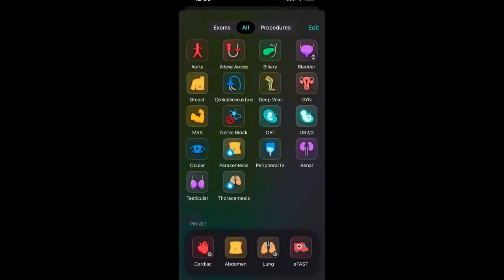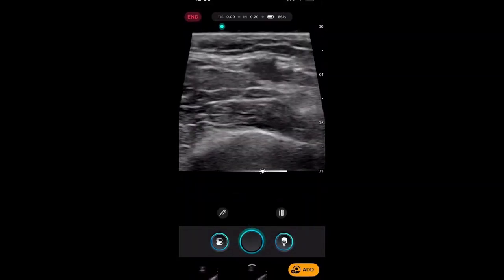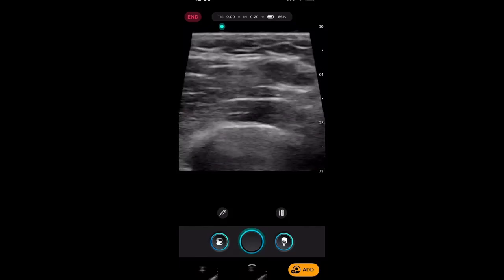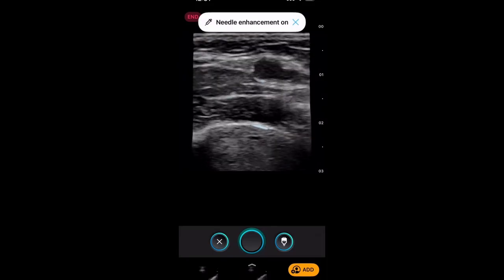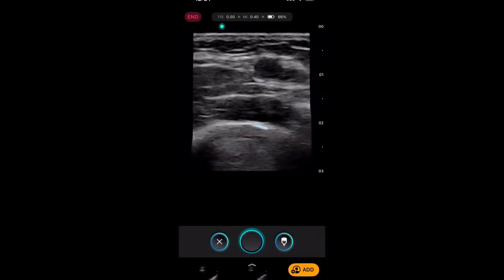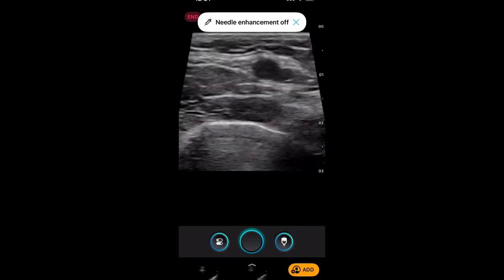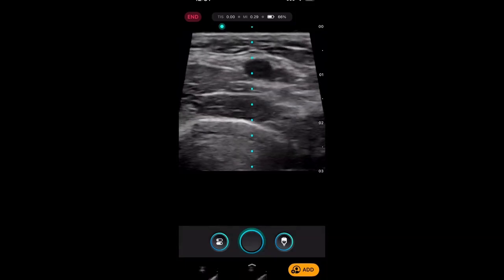Lastly, let's look at the veins. Here's my basilic vein. I can change the gain and depth right on my phone. The AI feature here is called Spot On, shown in the corner. When you turn on Spot On, it activates needle enhancement — so if you're inserting a needle, it enhances the needle visualization. It also has a midline marker for ease of placing an IV.